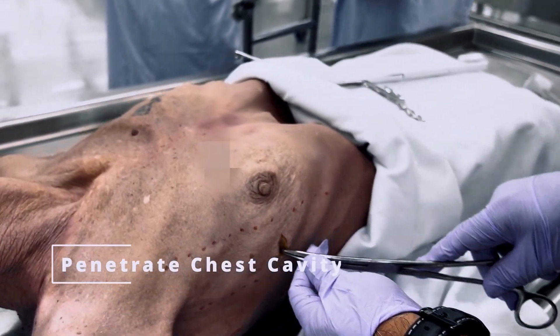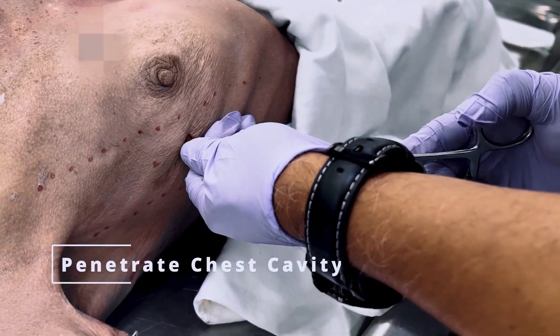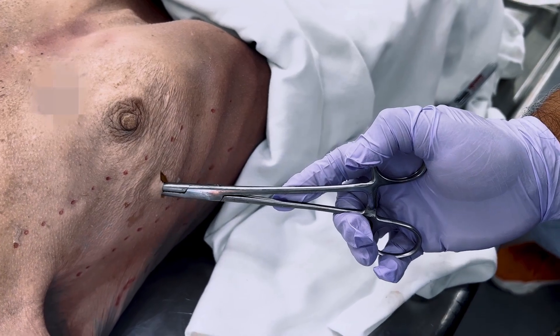Using 6 and a quarter inch curved Kelly forceps, palpate the rib and with steady pressure, going over the rib, penetrate the chest cavity until just inside the pleura, aiming caudally.